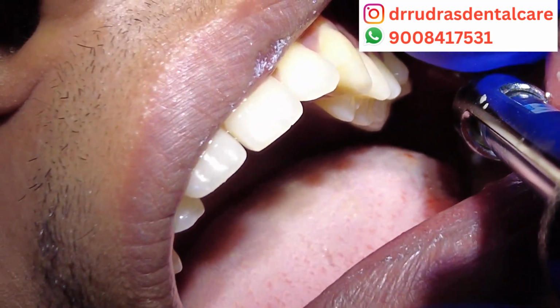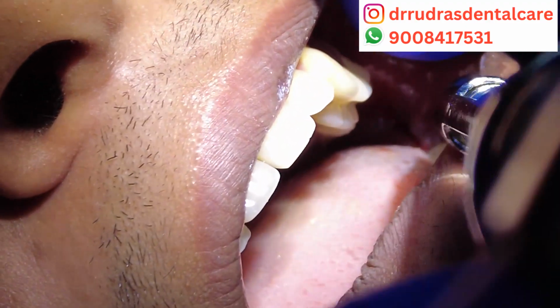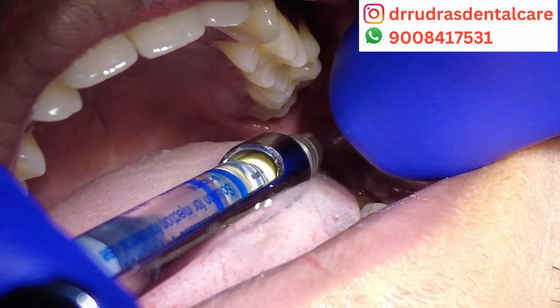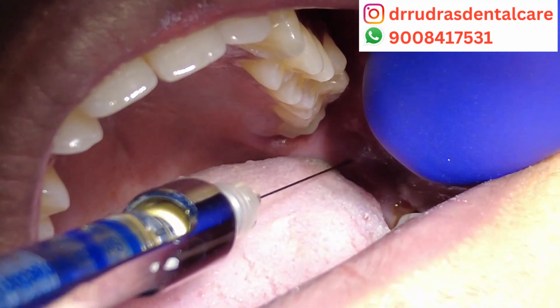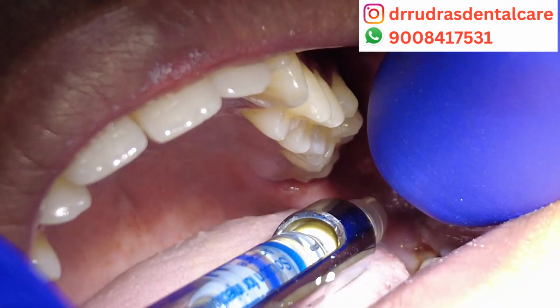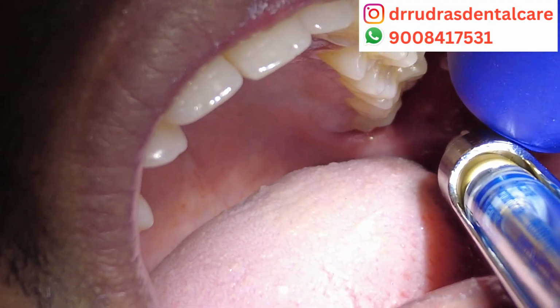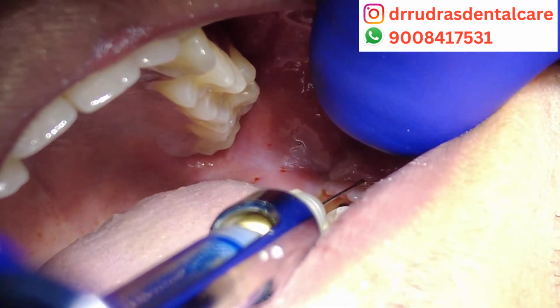As you can see in the following pictures in the video, we are giving the inferior alveolar nerve block because we are attempting the surgical extraction of an impacted 3/8. We will first attempt a non-surgical extraction. As you can see, we are giving the inferior alveolar nerve block followed by the lingual nerve block, and then we will give long buccal and local infiltrations so that the patient can undergo the extraction without any pain.